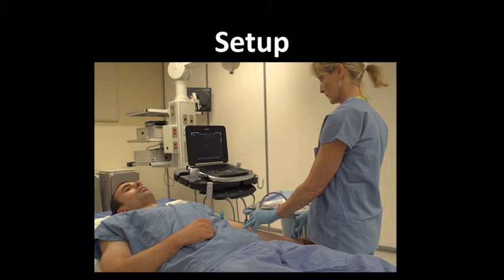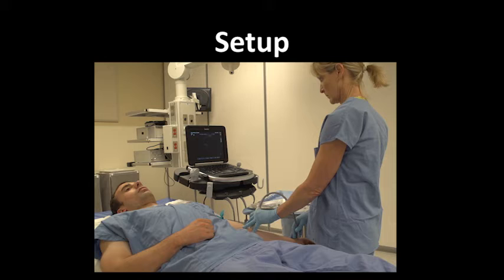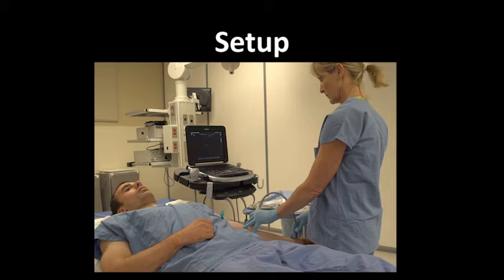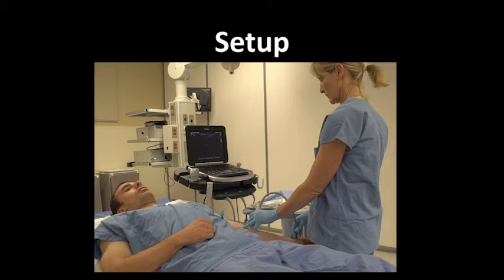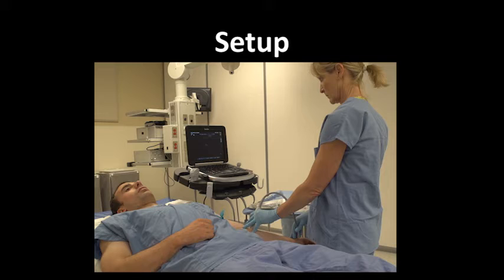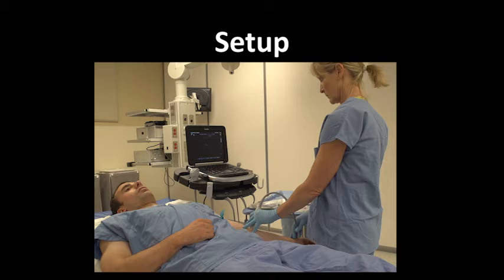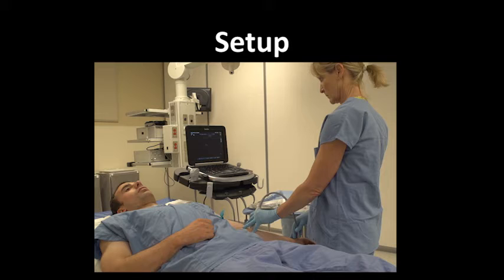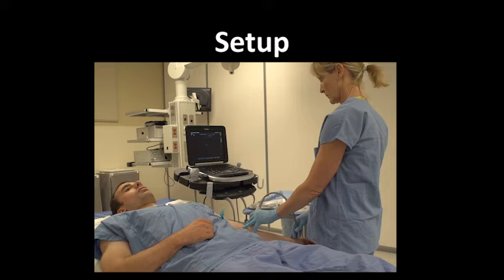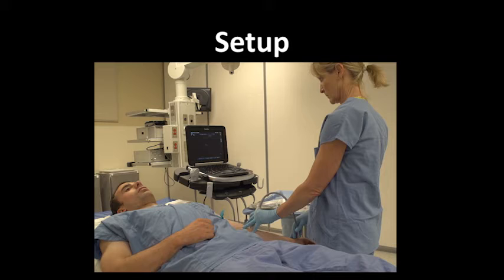Be sure to set up your ultrasound machine and patient's arm in your line of sight at all times, so that you don't need to turn your head to see between the patient's arm, your catheter, and the screen. Keep the probe marker turned towards the same side as the dot on the screen. In this example, both the screen marker and the probe marker are towards the patient's right side. Some providers prefer a seated position; when performing any procedure, it is important to be comfortable.